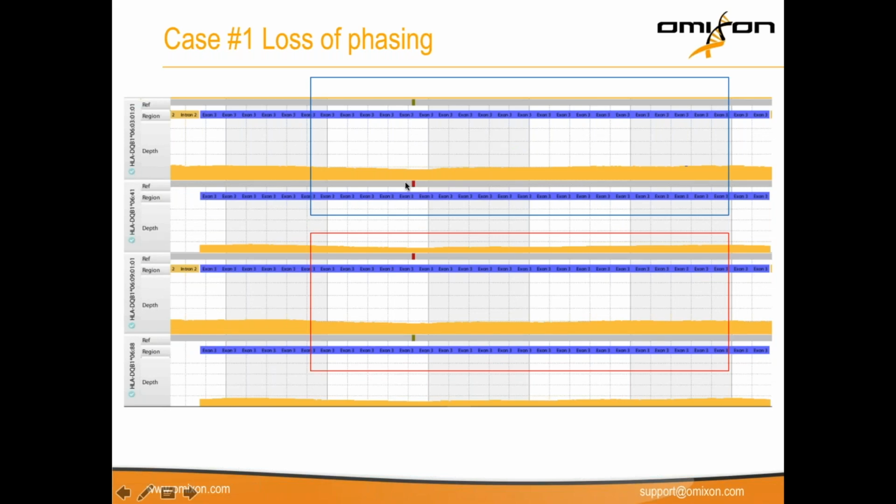Due to the phase break and the limited amount of reads available, as shown on the variance track, it's not possible to conclude whether the exon 3 that contains the A nucleotide belongs to allele 1, and exon 3 that contains the G nucleotide belongs to allele 2, and vice versa. So to resolve the phasing issue, we should try to reanalyze the DQB1 locus with more reads.